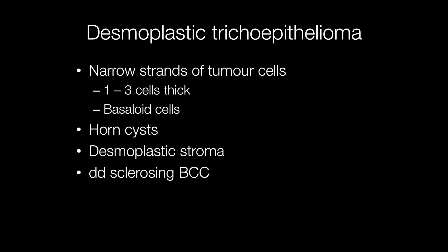Histologically, desmoplastic trichoepitheliomas are composed of narrow strands of basaloid cells, 1 to 3 cells thick, and these cells lie in a desmoplastic stroma. And here is the problem: because the cells are basaloid and because the stroma is desmoplastic, they can be misdiagnosed as sclerosing basal cell carcinomas.